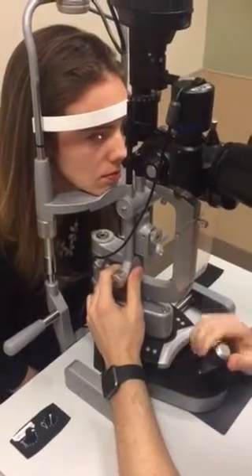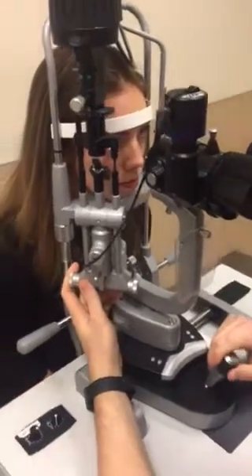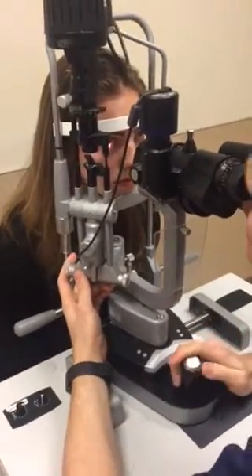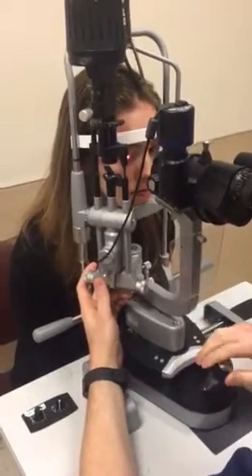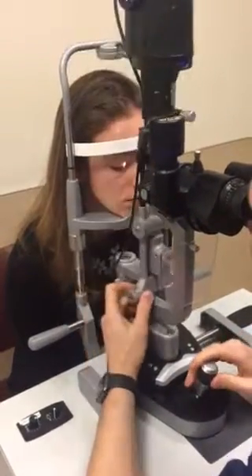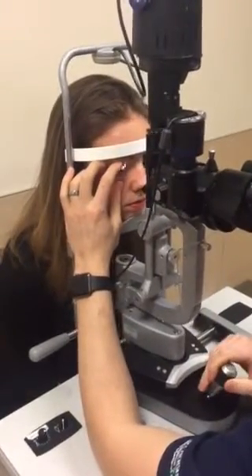Now we're going to look at the conjunctiva and the sclera. Look up, please. Look to your left. Look to your right. Look down.